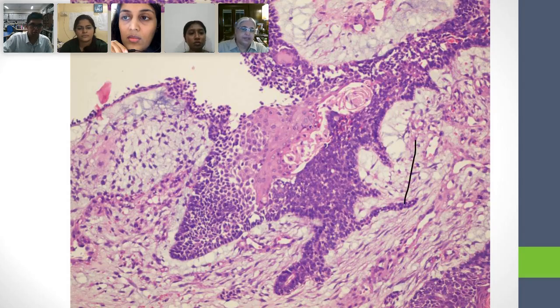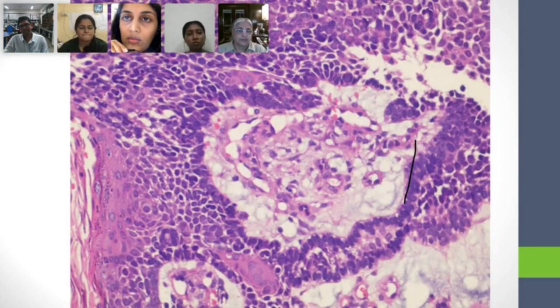Here you are. These are these little cords of cells that are attached to this epithelial island and are protruding from it. You can see that, right? Yes, ma'am. And if you remember, they loop back on themselves, and also where you saw that lattice-like framework, that is exactly what these cords are doing. All right, let's go to the next thing. Let's see if we can look at it at higher power. Now, what do you think? Do you think there's dysplasia?